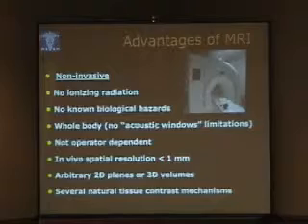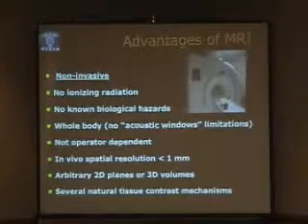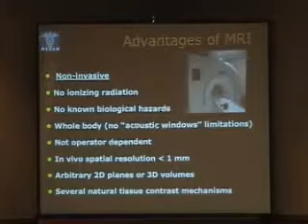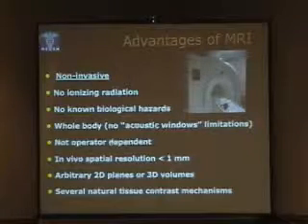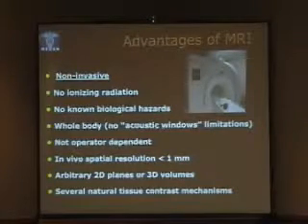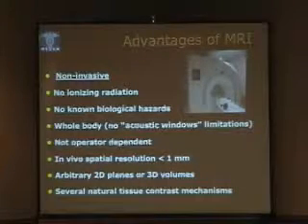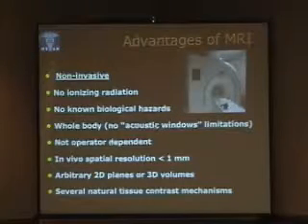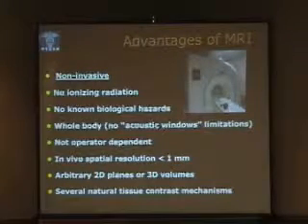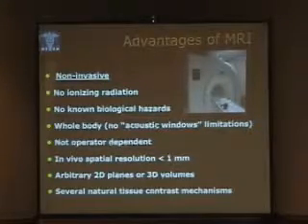It's not operator dependent, so it's not like an ultrasound probe that you can move around. The in vivo spatial resolution is very high. And as I will demonstrate here, it's really a technique that measures specifically the plaque. It's not looking at only one part of the plaque, like intima to media. It's not only looking at calcium. It's really looking at the burden of the disease, as will be described and discussed earlier by Dr. Fuster.